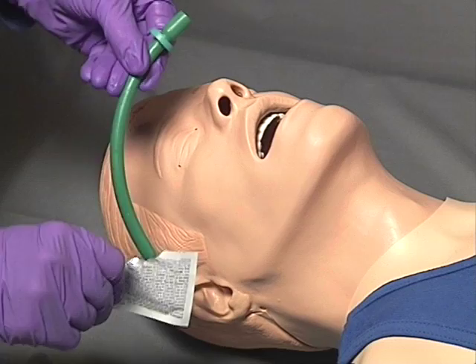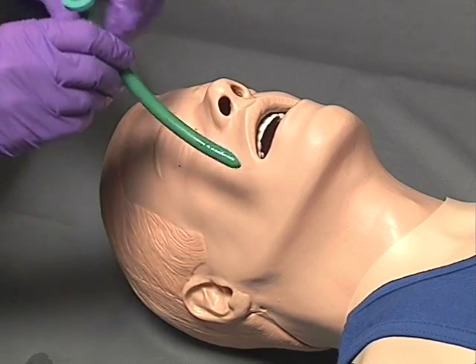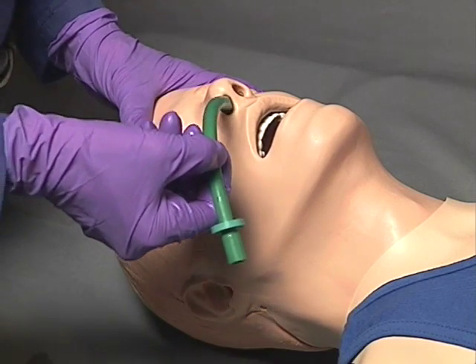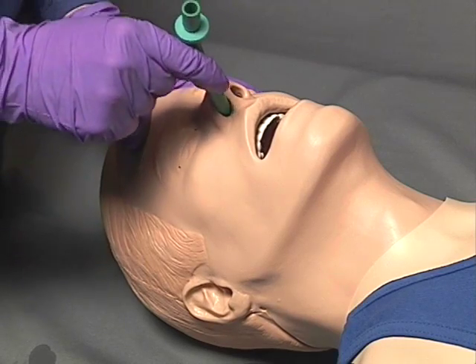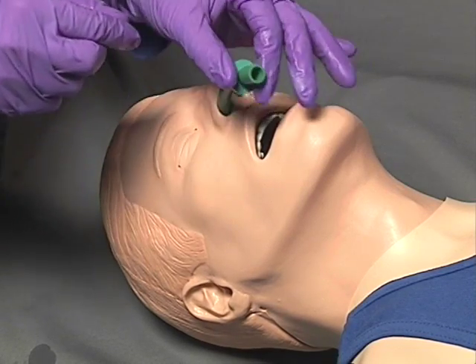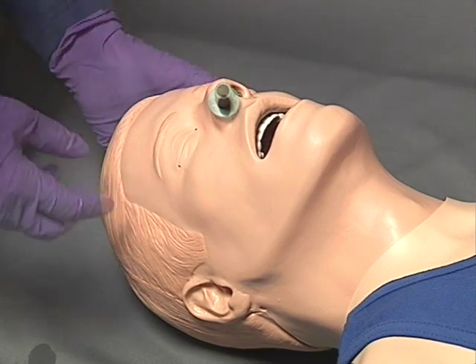If inserting the nasal airway into the patient's right nares, insert so as to follow the normal anatomical curvature of the nasopharynx with the bevel toward the septum. Direct the nasal airway along the floor of the nose into the oropharynx.